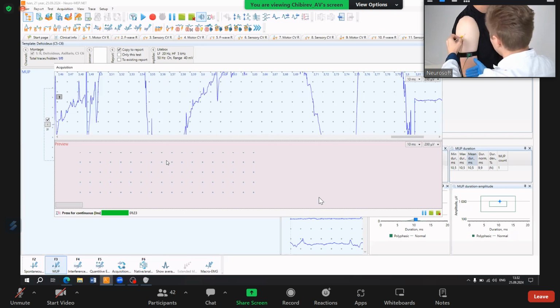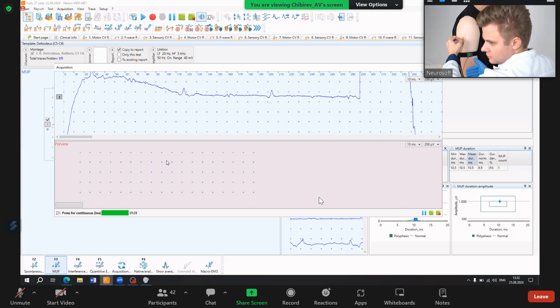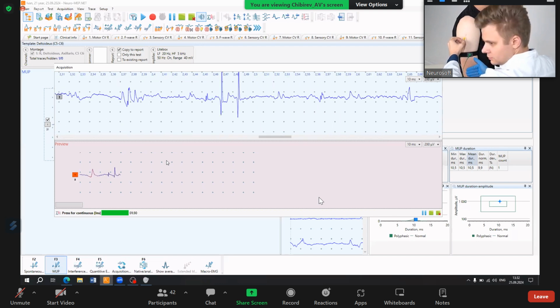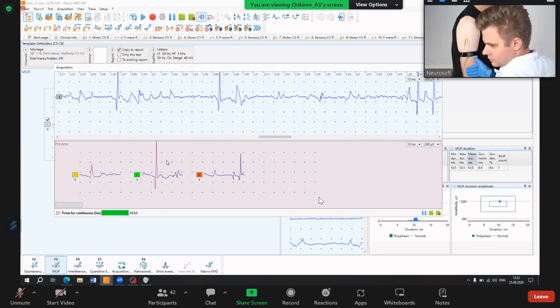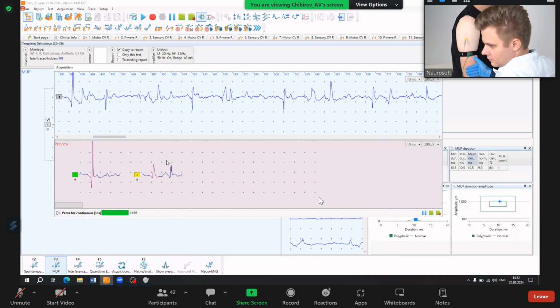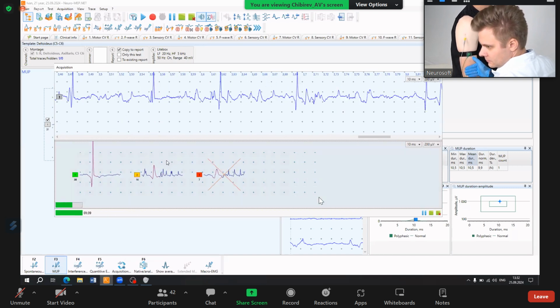Here, and move the needle, looking for the best. Okay, this point, good. Let's collect the data. Okay.